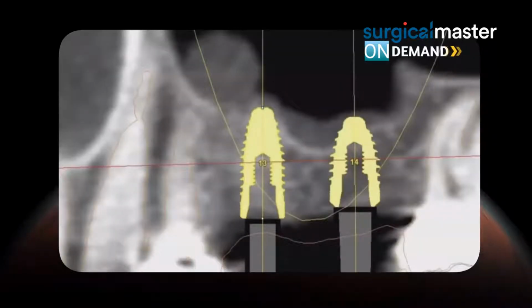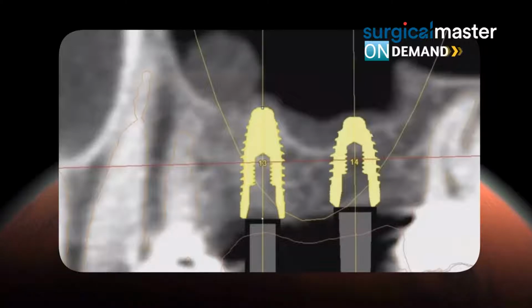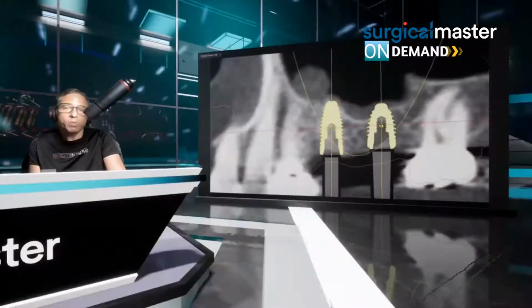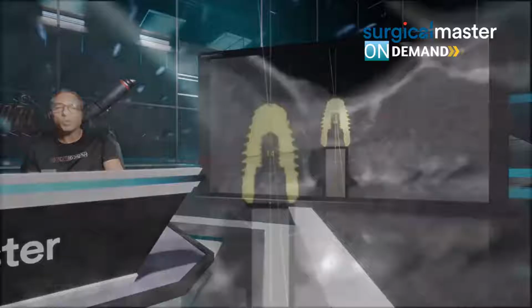Here's our computerized planning. This is a great case to start. By the way, that's the most common scenario. How many bridges fail every week in your practice? Not necessarily your bridges, but even your bridges after 10, 20 years can fail. Teeth can crack. Teeth can get infected. They can develop periodontal disease, periapical infection that are not treatable. And then you got yourself an implant opportunity.